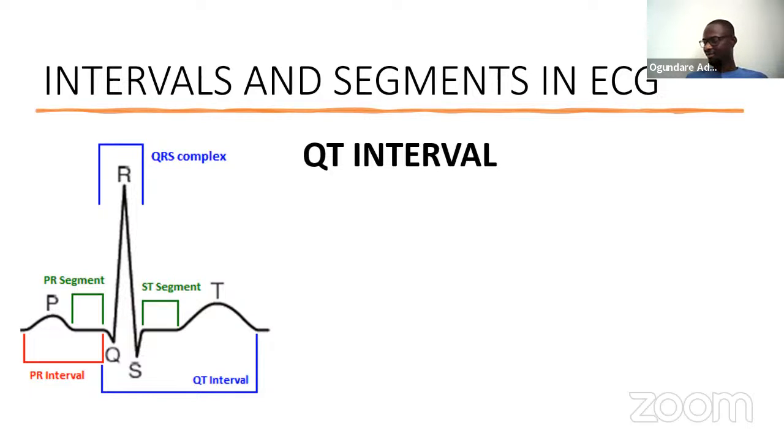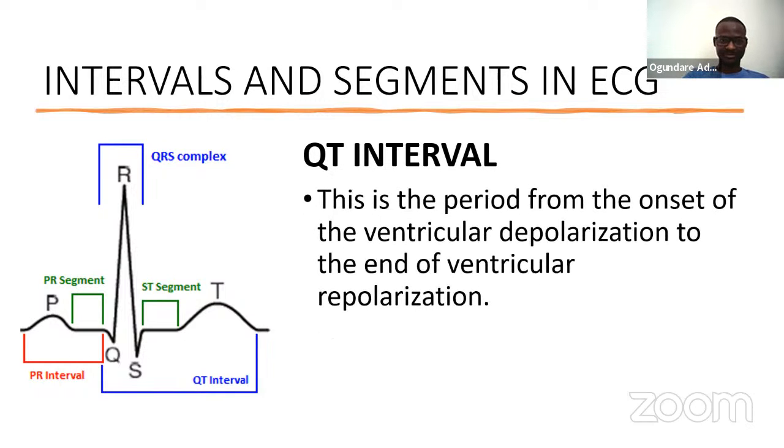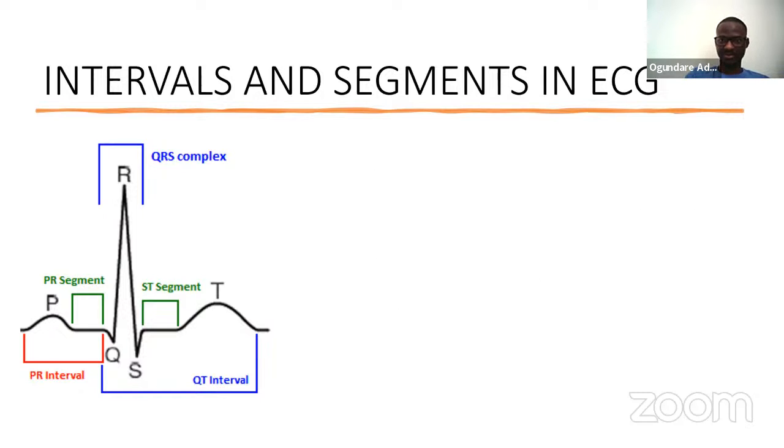The QT interval, nobody's typing that yet. From the screen, we can see the QT interval here in blue. You can see the QT interval here.